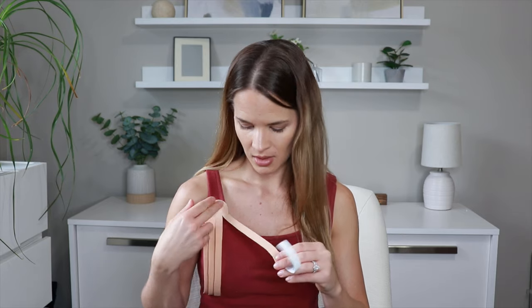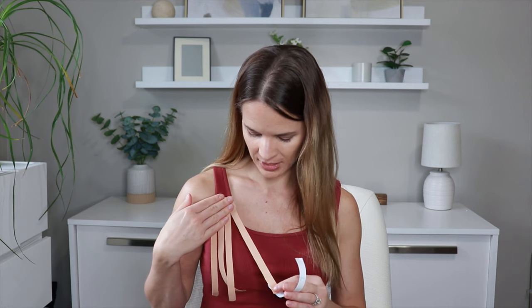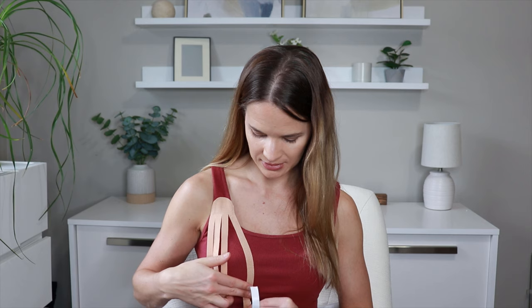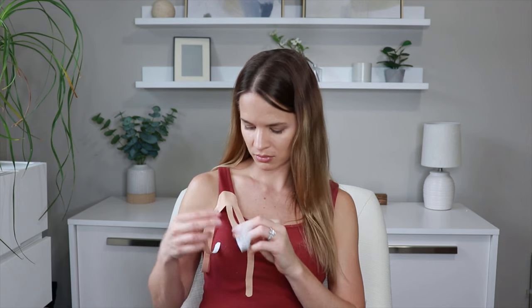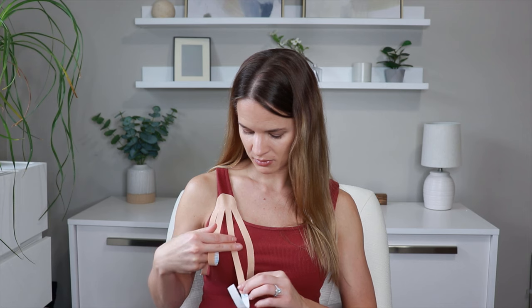From there we take our strips and go directly over the swollen area. Take one strip at a time, peel back the paper leaving about an inch at the end, and place it down — you don't want a ton of tension, just a subtle tension, enough that it gives a little pull. Guide it to the area that is swollen: I'm going to do two on one side and two on the other. The last little bit we don't want tension on, so just pull the paper away and push that end down without any tension. Then do the next strip: peel it all the way back, leave that inch or two, just a slight bit of tension, then place it down at the end without tension.